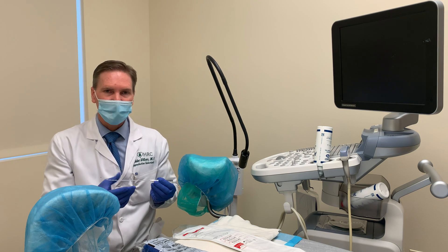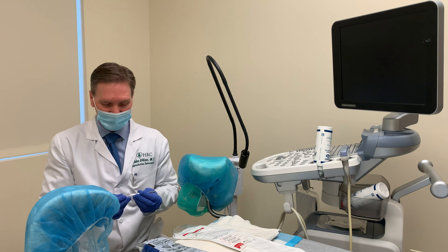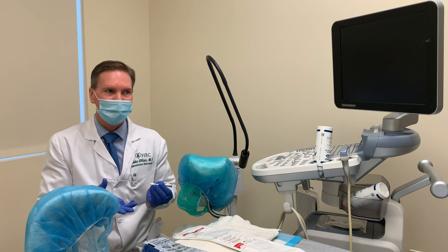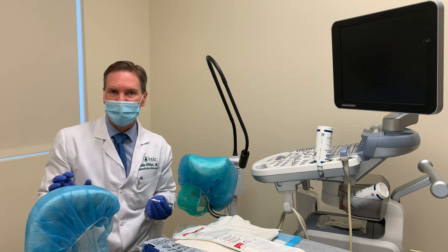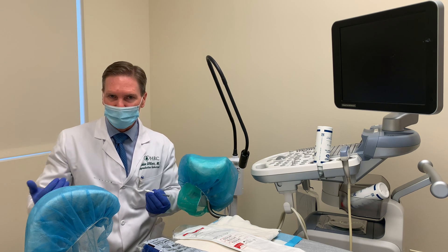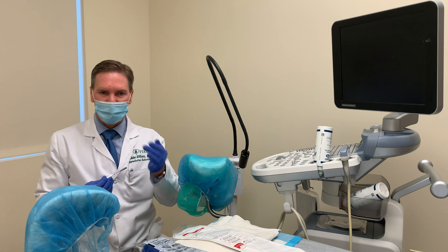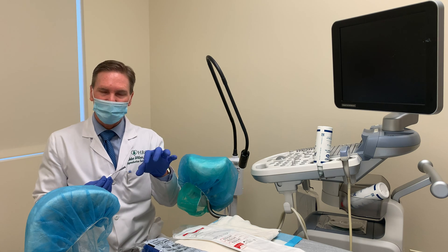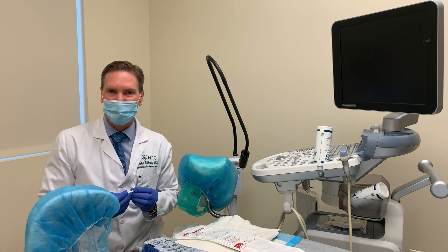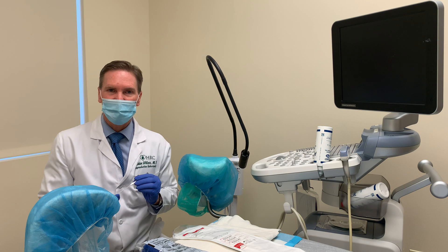The whole transfer only takes about two or three minutes. I like to set the catheter in advance, have everything ready, and then have the embryologist bring the loaded catheter in so that my guide is already in place, and I can just slide the inner catheter in and do a very easy transfer.